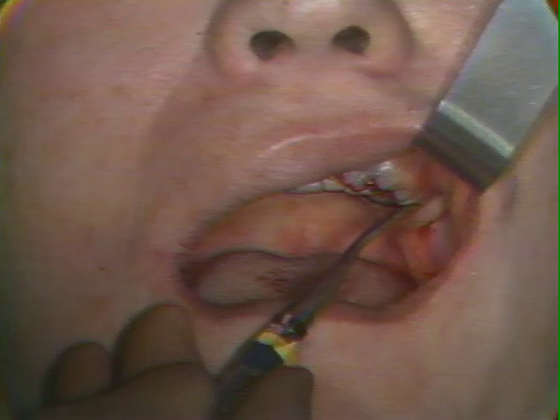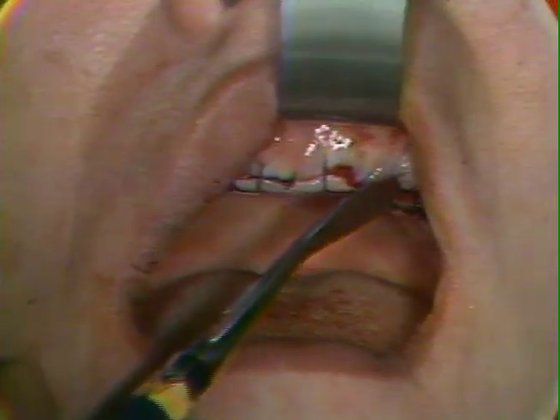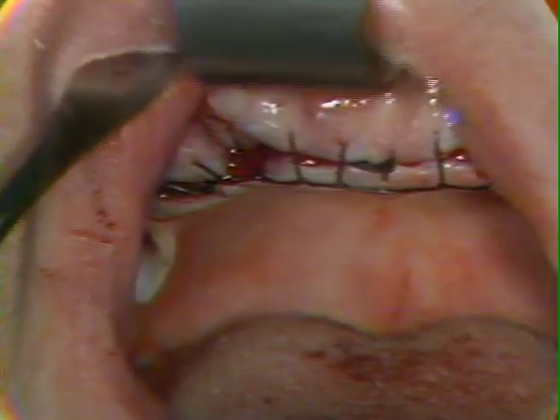Now, it's not possible to get through both flap margins appropriately when they're spaced at this distance. So to get equal depth and equal distance and bites of tissue for securing of the sutures, we must do it in that manner. So we have then the first of the series of continuous locked sutures that we will also use on this side. Here we have completed this suturing of these flaps. You can see they're now readapted fairly well over the modified bone.